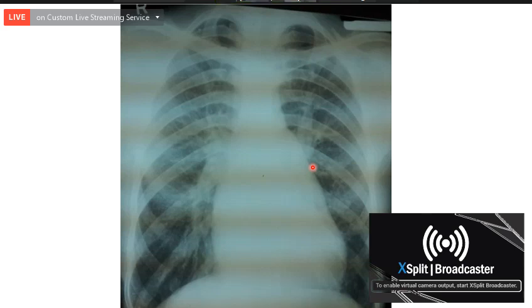So here, is the patient having Kerley B lines? There are a few Kerley B lines. If you are very careful, can you see some lines here? Yes, sir, there are some Kerley B lines. Yes, very good. And you can see peribronchial cuffing.